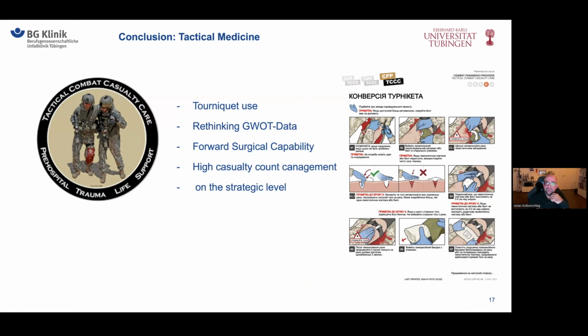Thank you very much. We have one more question from the audience. Are there any novel materials that can be used to prevent infection? Are all of the osseointegration implants made out of titanium at the moment? At this moment, osseointegration implants are made from titanium.